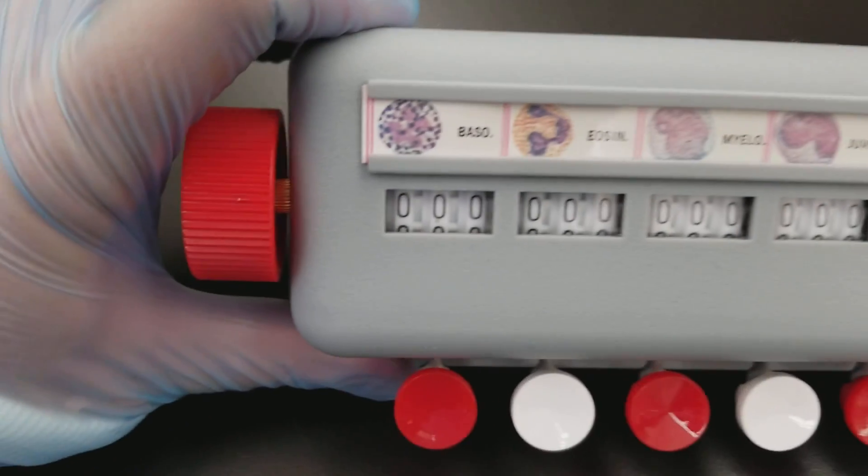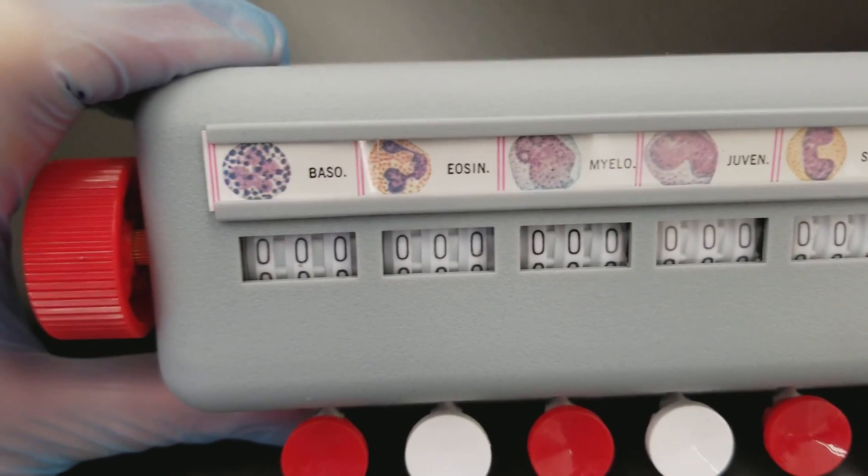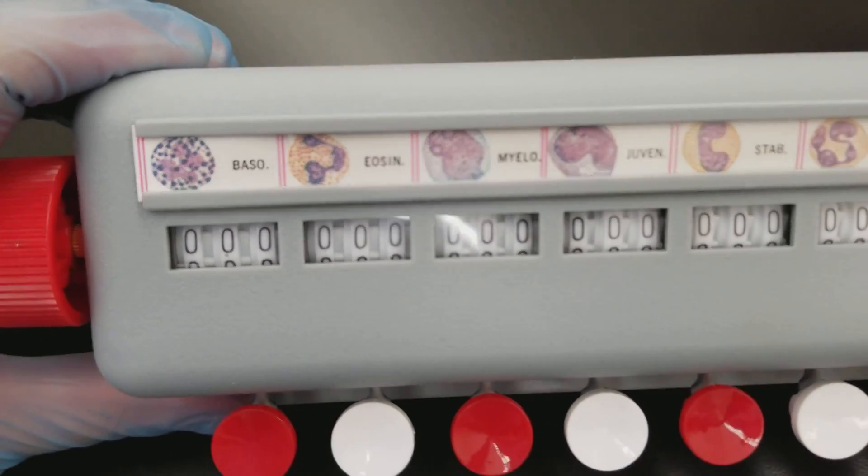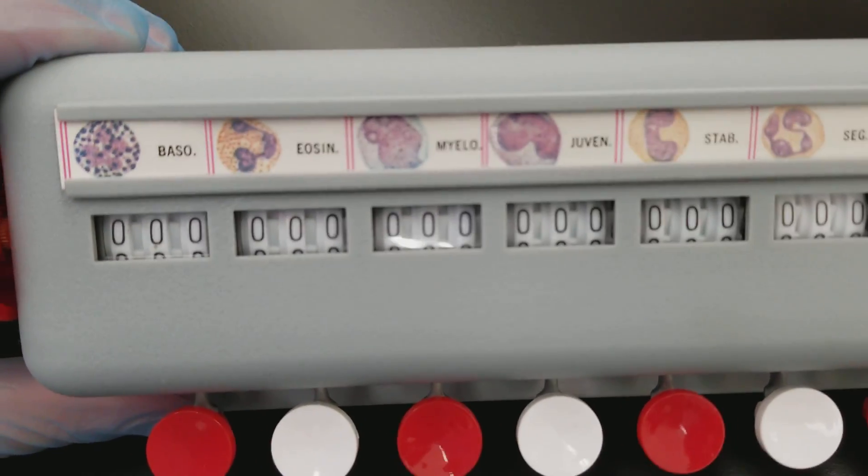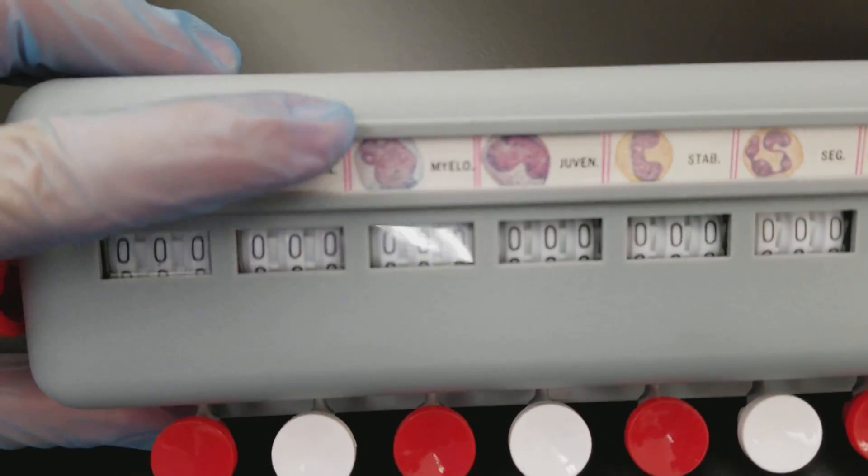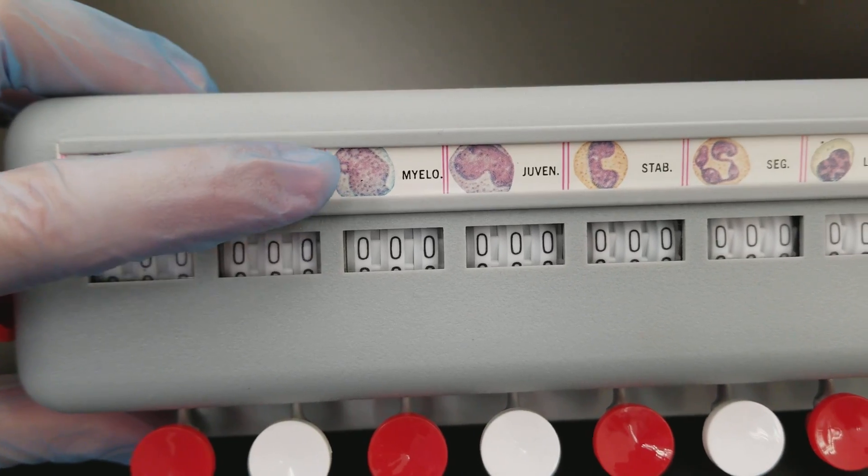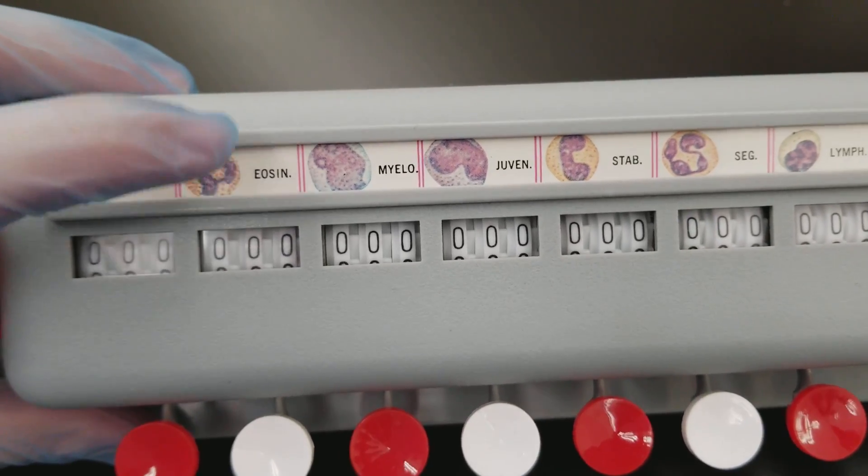So you have the basophils here. It gives you a beautiful picture of what they look like. The eosinophils, we have myelocytes here where you can see that they've got the nucleoli and the nucleus and a little bit of granulation there.